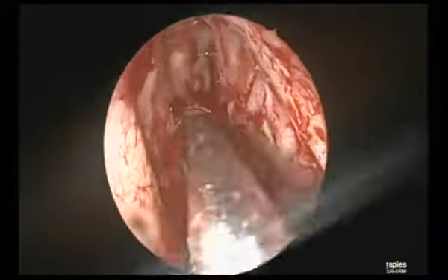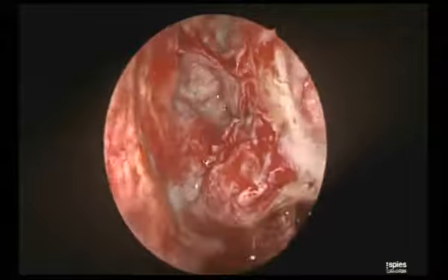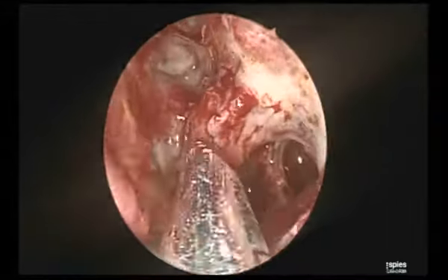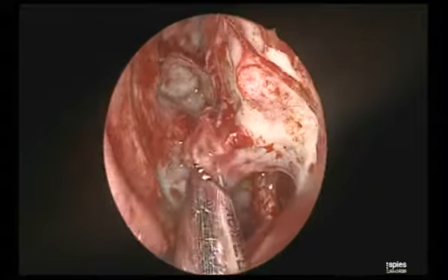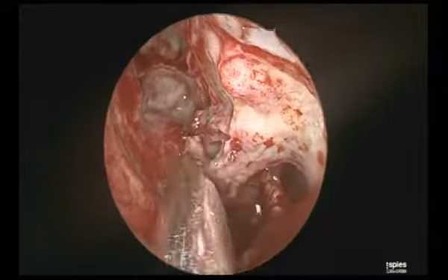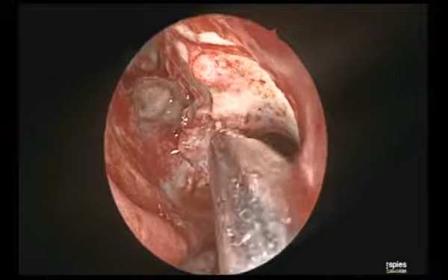Now what you see here, so far, that's your anterior ethmoidal artery. Now lower down is the inferior remnant of the bulla ethmoidalis, which I am going to take away. Ashish, you asked me when to deal with the Heller cells. This is the time when I deal with the Heller cell. Now see, it looks like a small Heller cell as well.